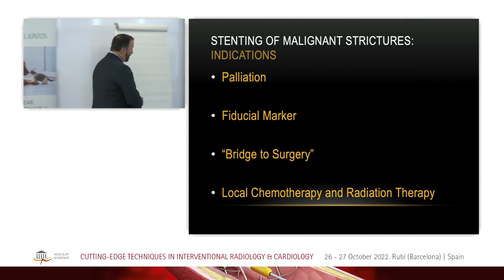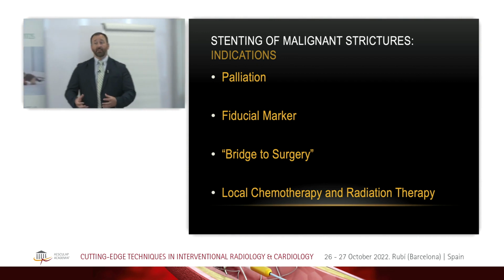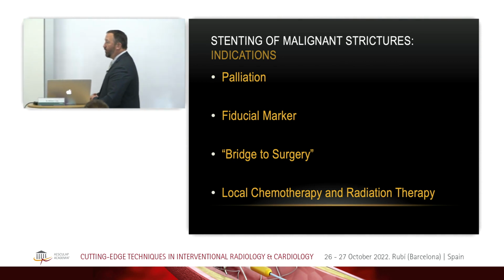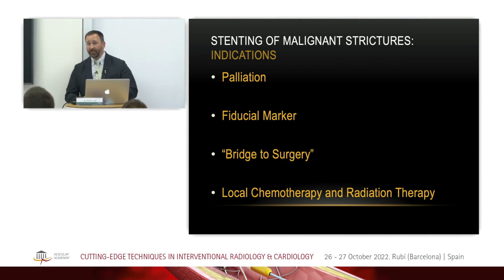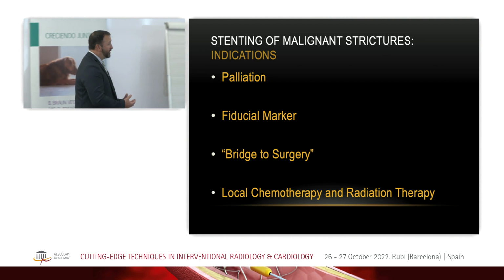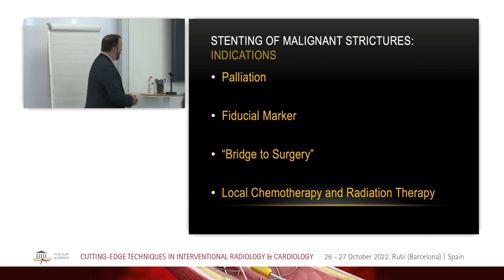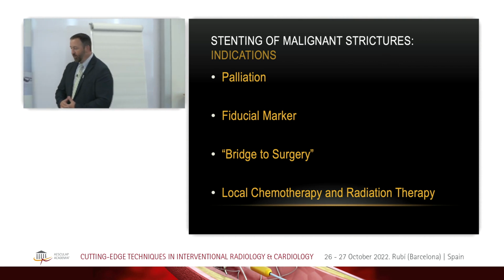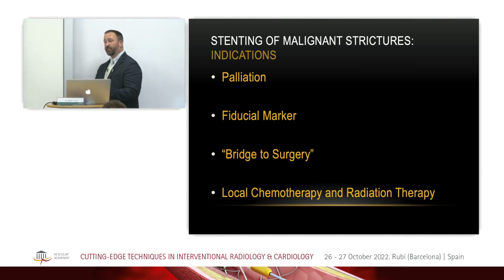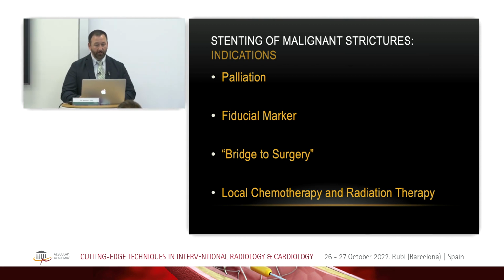One of the other cool things about stents is that if you do have them covered, if you place one of those coverings in them, you can put things into that covering. And so most commonly in humans, this is done for coronary disease, where they're trying to prevent them from clotting off those stents. That's the biggest complication for coronary stents, is that they get thromboembolic disease that closes them down. And so they'll put antithrombotics directly into the covering over the stent. And so we're not at this point in vet med yet, but it's something that we're starting to look at, is that could we potentially put chemotherapy into these stents, into the covering of the stent, and locally deliver chemotherapy directly to these tumors. So I think that's something down the road to consider.